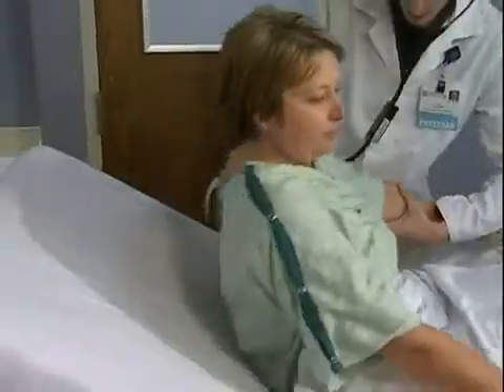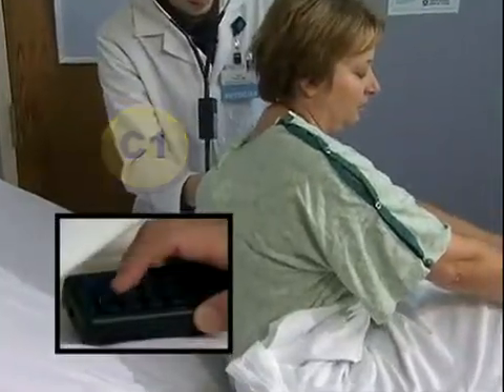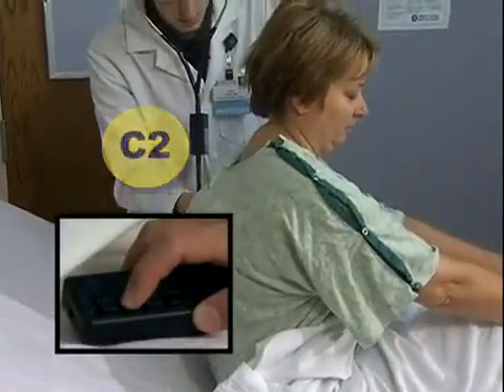When using breath sounds, the standardized patient must select the correct button and time the press and release to match the start and stop of inhale and exhale.